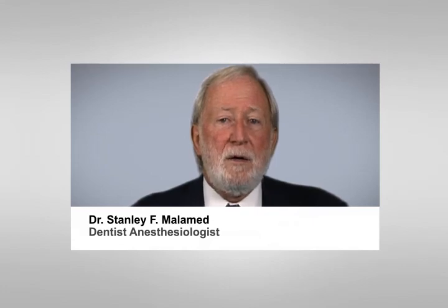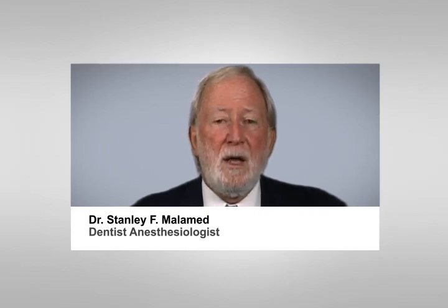You will find that using the STA system, using the STA wand handpiece and birotational insertion technique will allow you to deliver a more comfortable mandibular block with a greater success rate and a shorter onset of anesthesia.